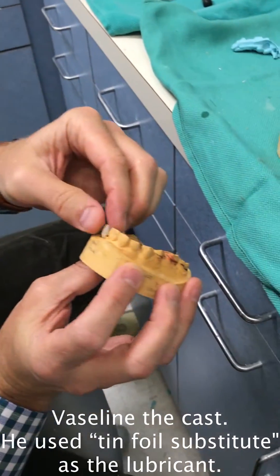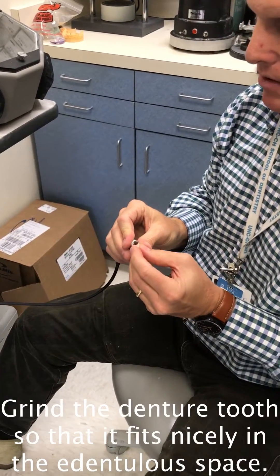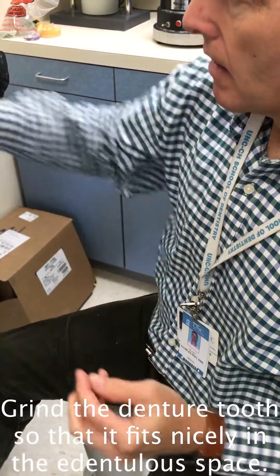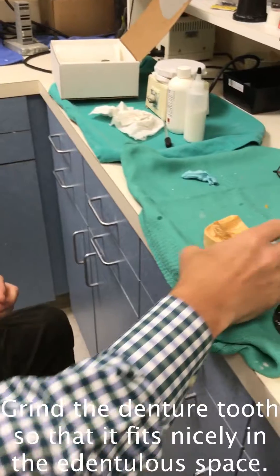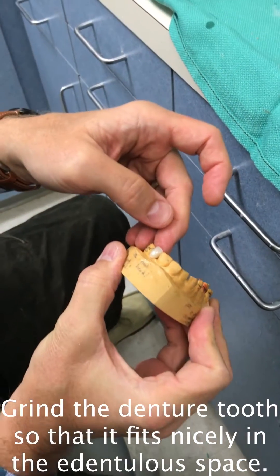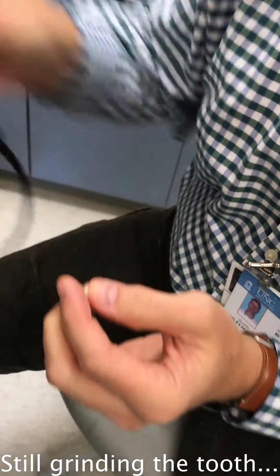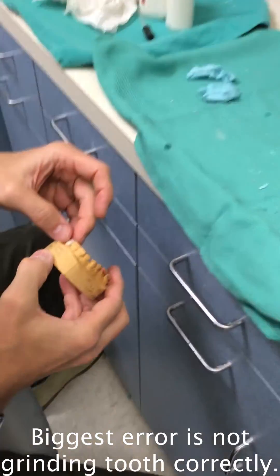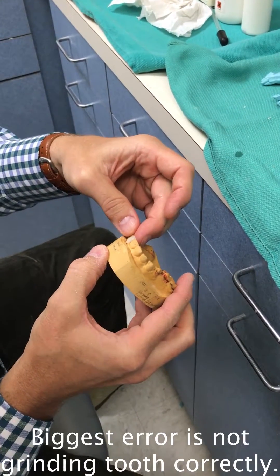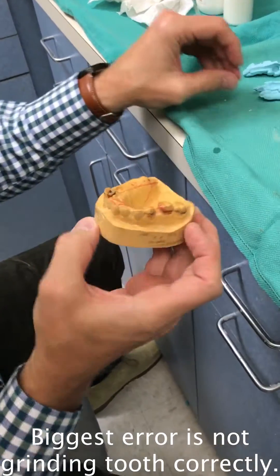So I'm fitting this tooth in — we're going to need to sort of custom grind it. One of the biggest errors in my estimation is just literally sticking a tooth there and it ends up looking like garbage. The biggest error people make is taking off the wrong part of the tooth and then you continually cannot fit the tooth where you need it to go.